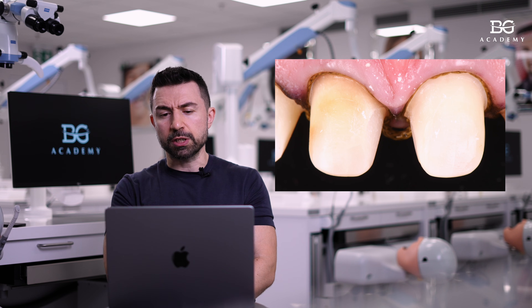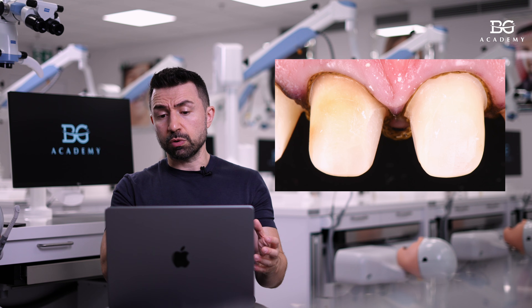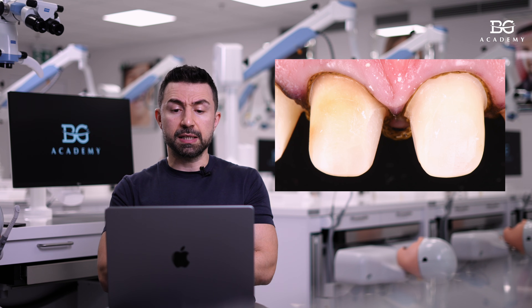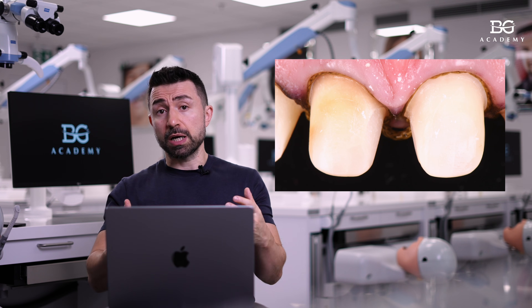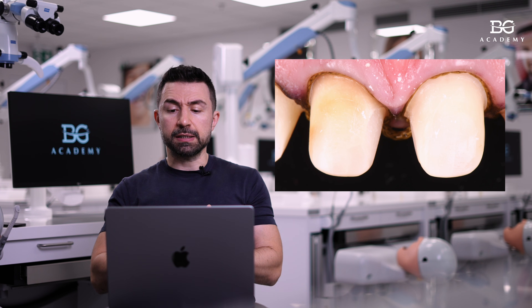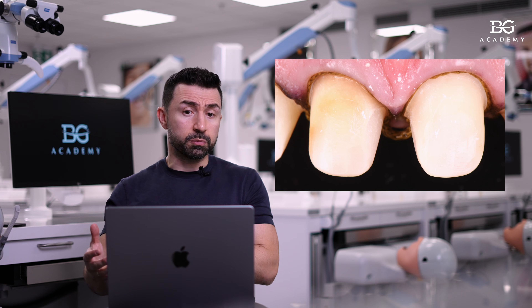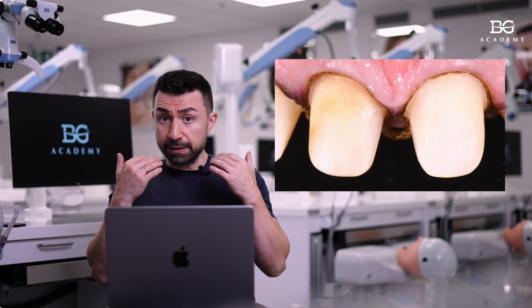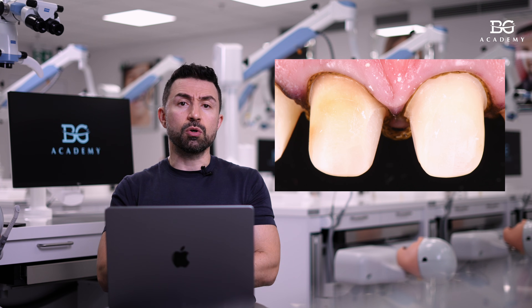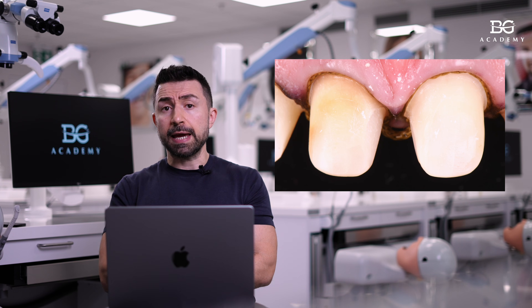Just after preparation, you can see that on tooth number 11 we still have composite material on the mesial side. There is a concept called deep margin elevation, and there are studies showing that we can keep our preparations on composite. Personally, I prefer in the anterior area to keep my margins on the teeth, not on the composite, especially if we have enamel there.